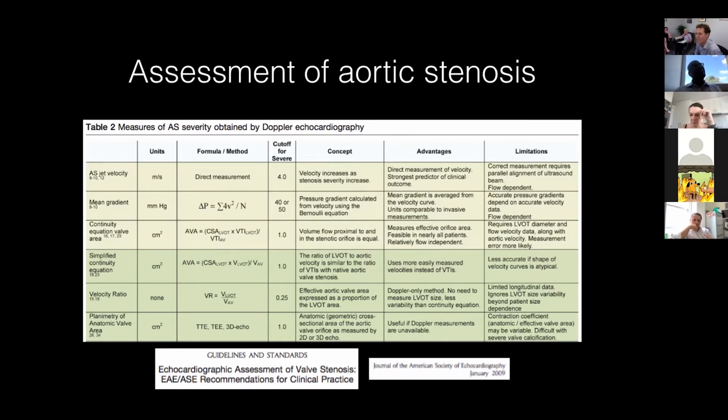I know it. Yeah, it's turning down the gain. You just got to turn down the gain. Yes. If you turn up the gain, you get all the fuzz that comes in. As you turn it down, that decreases, and you just get left with that modal velocity, as you said. Very nice. And then you just got to make sure that you trace the outline of the parabolic flow as accurately as possible.